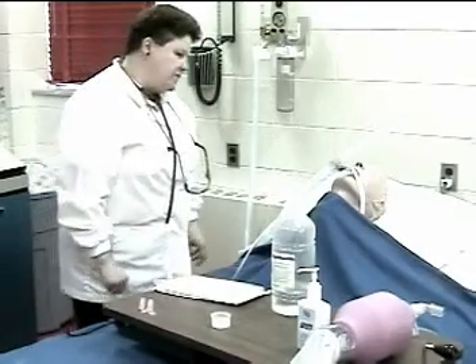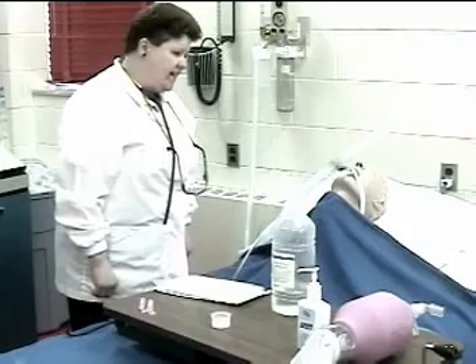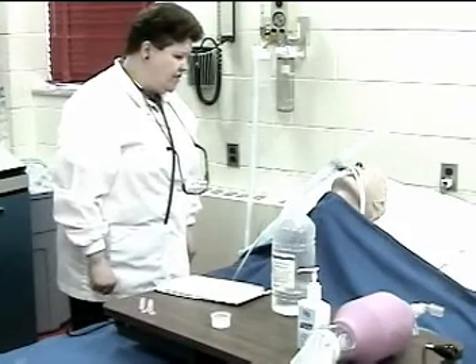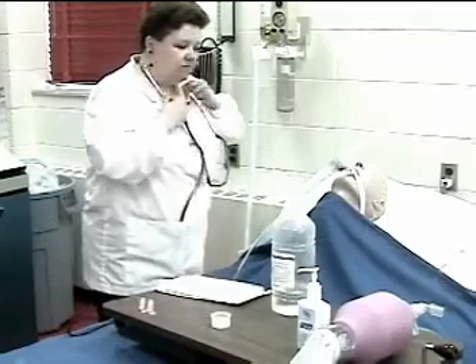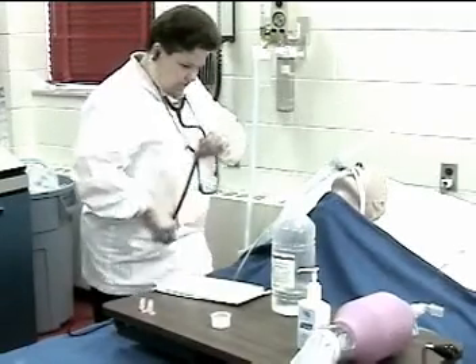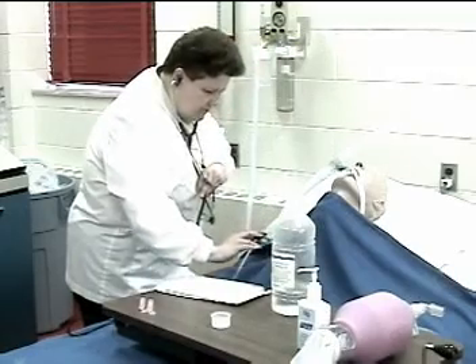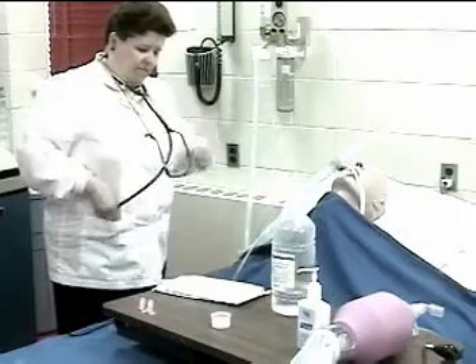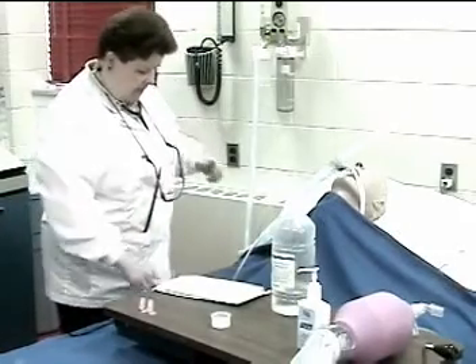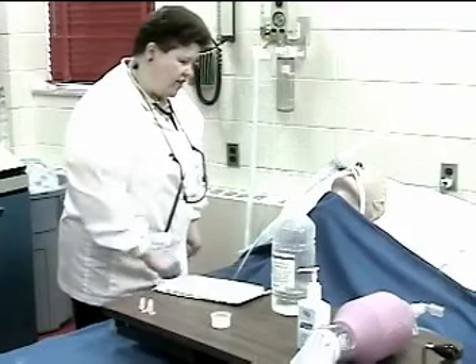I'm one of the respiratory therapists assigned to this floor today, so I will be coming in, checking on you, and suctioning as you need to. Before I get started, can I just listen to your lungs? Sounds a little bit gurgly in there. How about if I suction you while I'm here? I'm going to put this pulse oximeter on your finger to help me keep track of how you're doing.